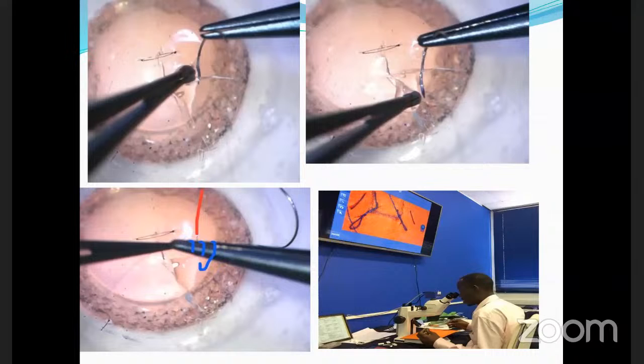And suture tying practice has to be done very regularly. This is one thing which gives you the best hand-eye coordination. This makes you ambidextrous. You can use a simple thermocol with a suture, and tie the sutures regularly. That will give you the maximum hand-eye coordination and good suturing practice also.